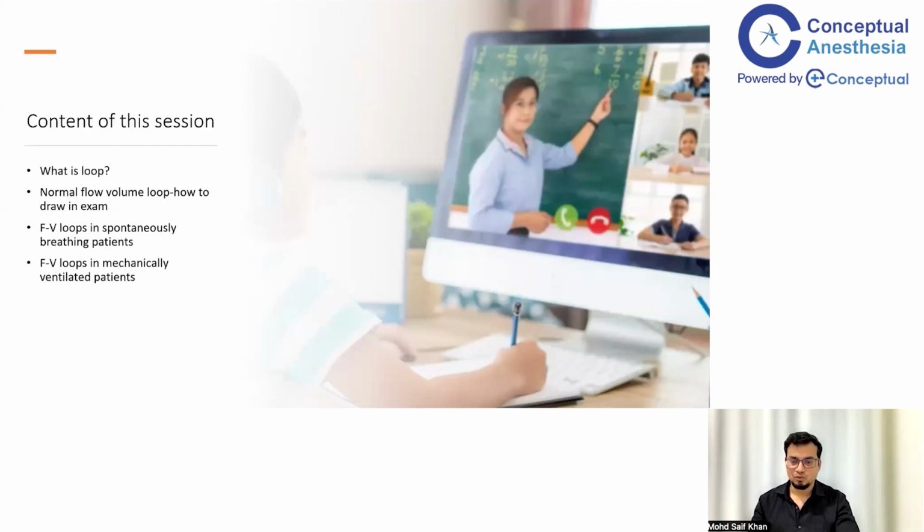So the content of this session will be as follows. We will learn what a loop is. Then we will know what a normal flow volume loop is, and how to draw it in the exam for a patient who is spontaneously breathing. This is more important in patients who are cooperative, who can perform spirometry. As you know, the flow volume loop can only be obtained in patients who are cooperative and who can forcefully exhale. So this is how we obtain the flow volume loop in a spontaneously breathing patient.